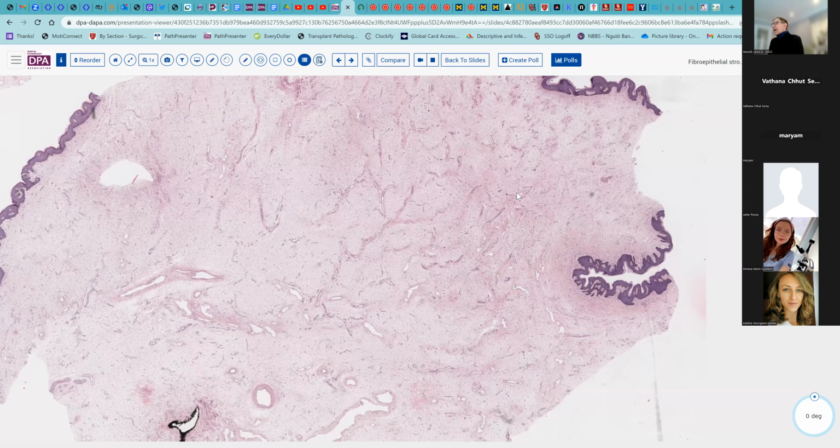Additionally, endometrioid carcinomas generally tend to stain in a splotchy pattern with P16. And so if you've done a P16 thinking it's cervical, and you see instead this patchy, splotchy pattern, a few cells here, a few cells there, well, that's much more likely then to be endometrioid than gastric, which will usually be uniformly negative. So, Dr. Agarwal's, your answer there, very useful. Hormone markers, likewise, would be useful, positive in endometrioid carcinomas for the most part.